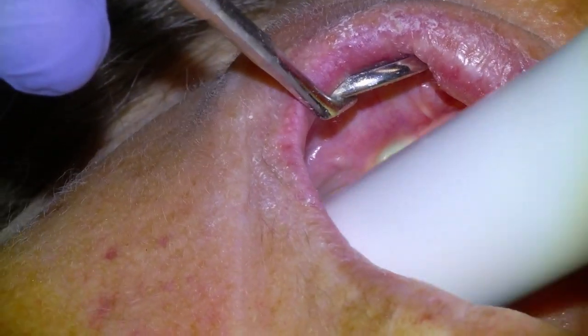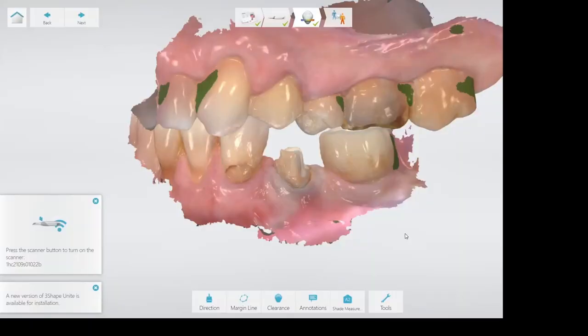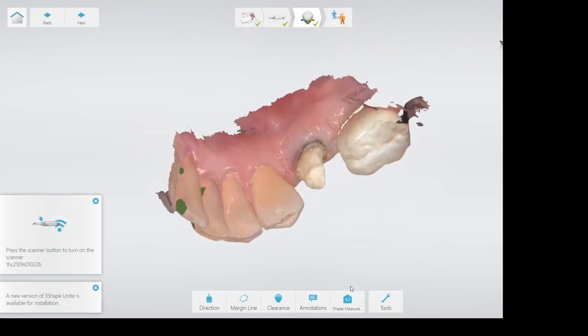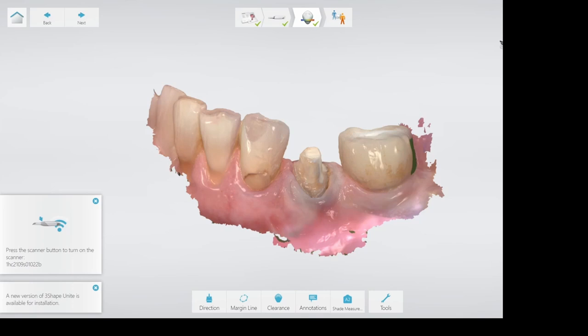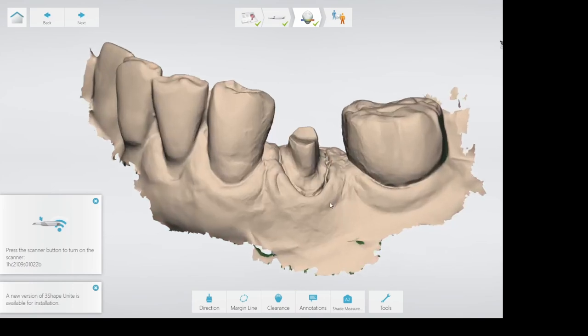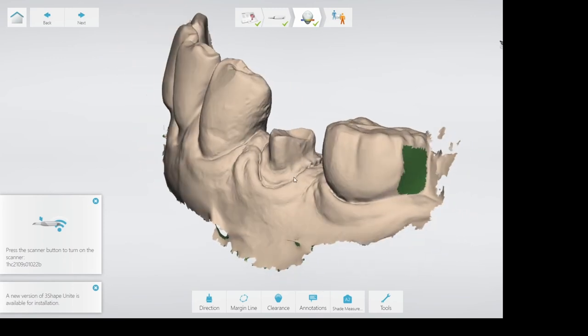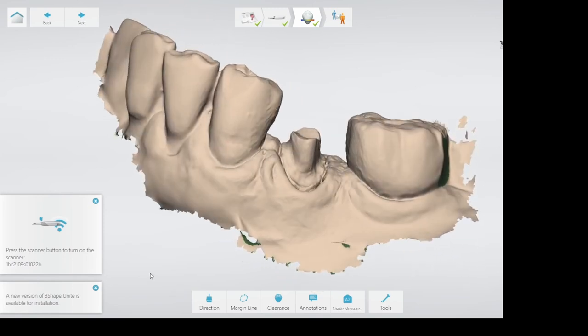Big fan of the Trios 4. I'll take the scan and then send it to my designer. Here's the scan — I'll send it to the designer and then I'll actually get the design back and mill it in-house with my milling machine personally. Maybe I'll show that in a future video.